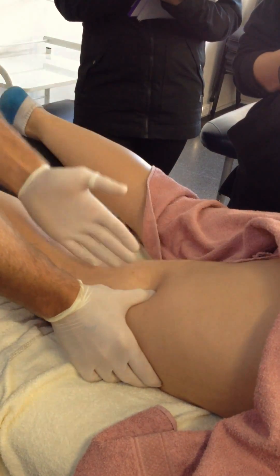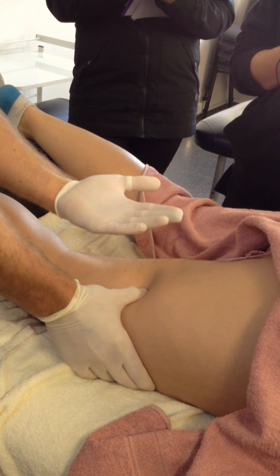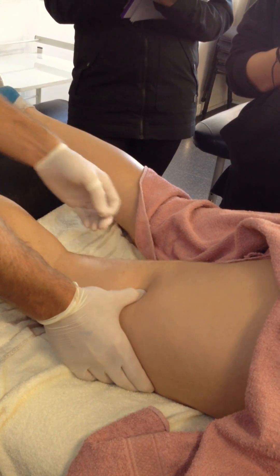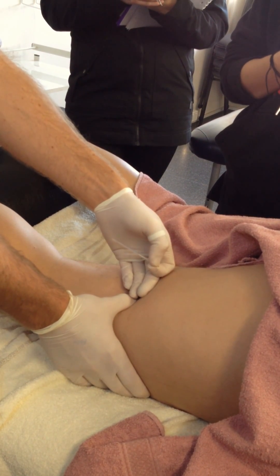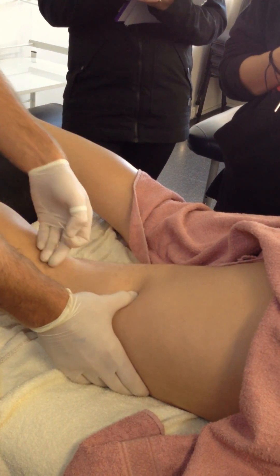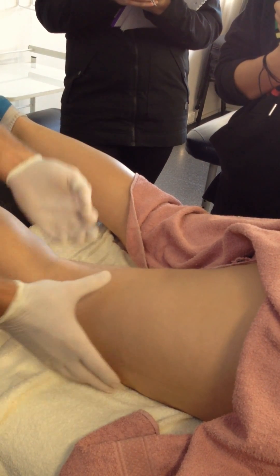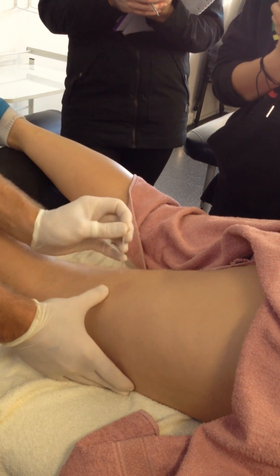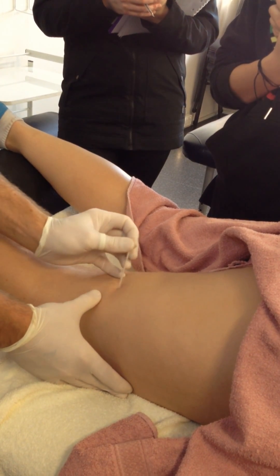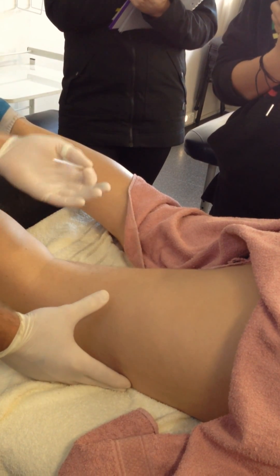Through here the sciatic nerve is quite deep — it's deep to the muscle. This becomes more of a caution with your needling as you come further down, because it's obviously less deep as the muscle is not as bulky through here. So with that, we would always try to tip the needle laterally, going away from the midline and away from the sciatic nerve.